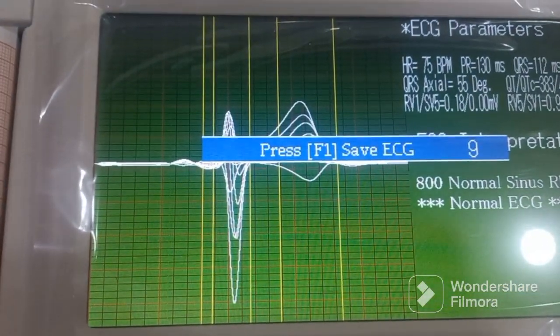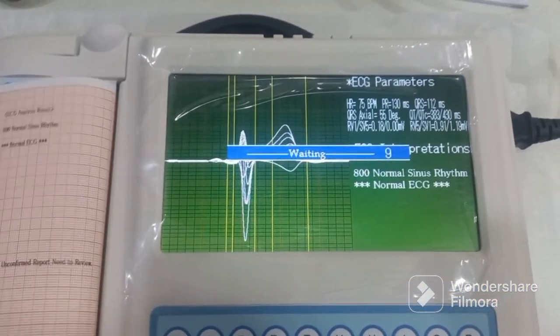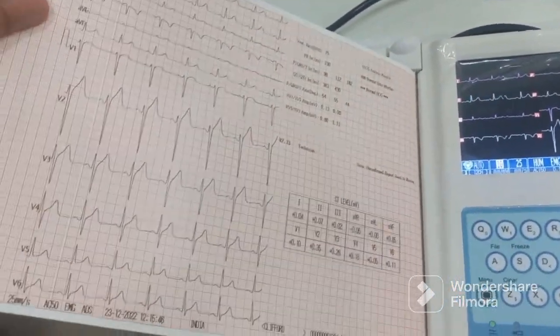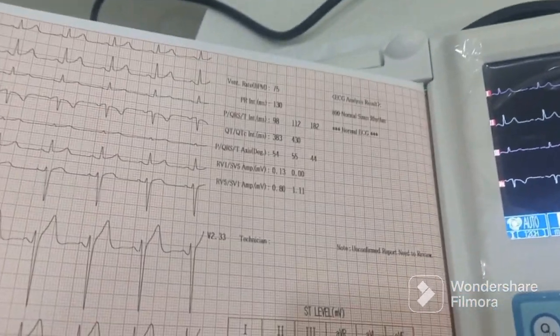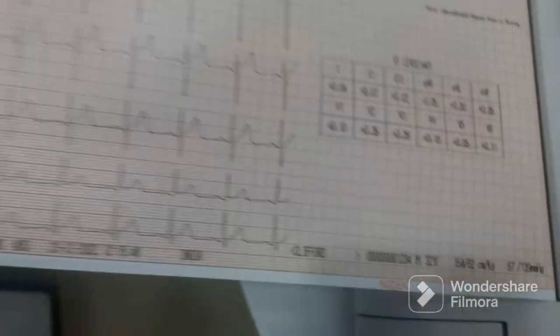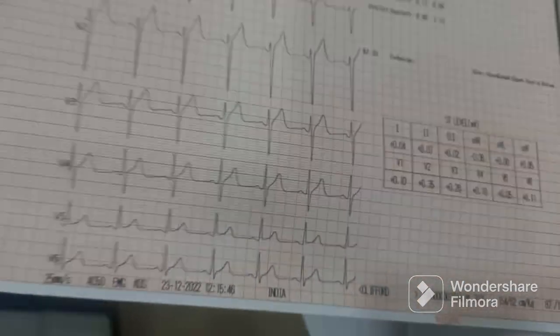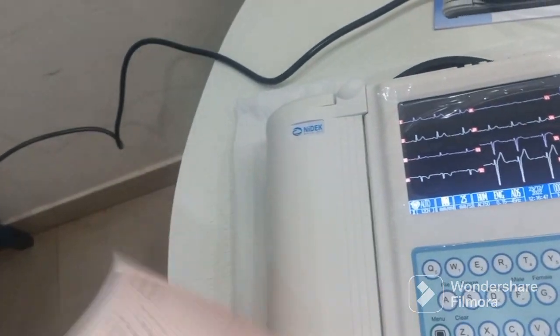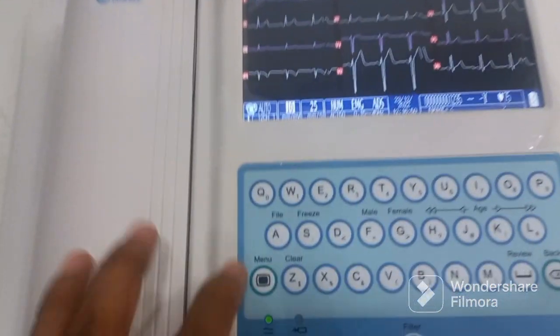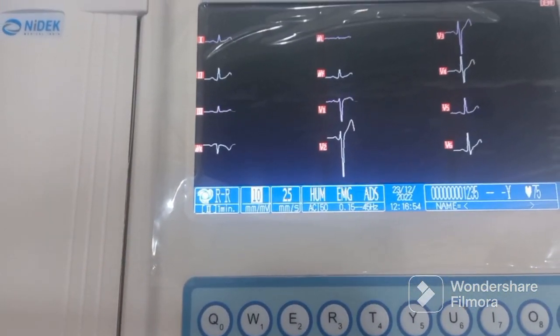If you want to save this ECG, press the F1 button. Once you press this button, your ECG will be saved. This is how the print will look — the waveform, all the interpretations and analysis, along with all the patient data.